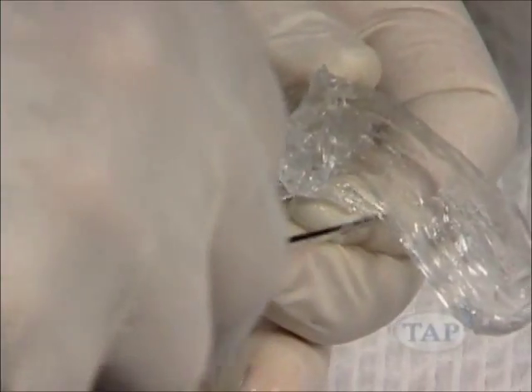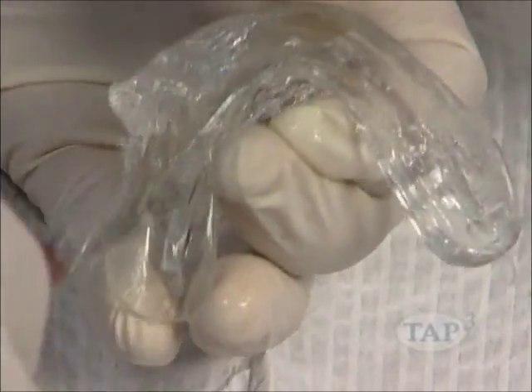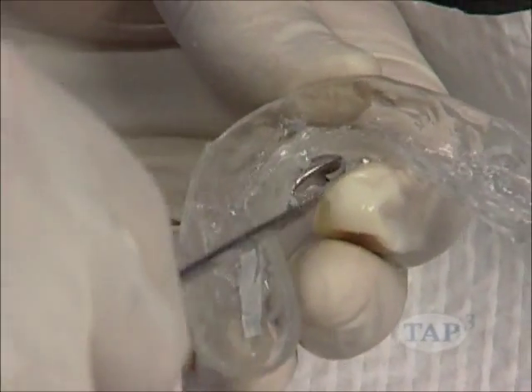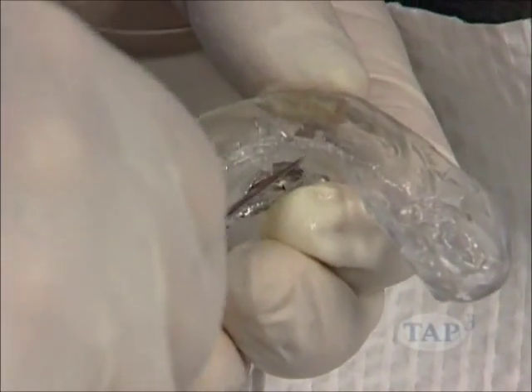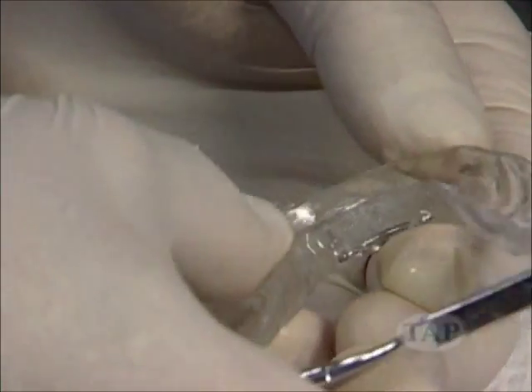Heat and remove the old thermocryl from the tray using a spatula. The thermocryl is ready to be removed from the tray when it turns clear and soft. Be sure not to use water hotter than 160 degrees or leave the tray in the water too long. This may warp the tray.